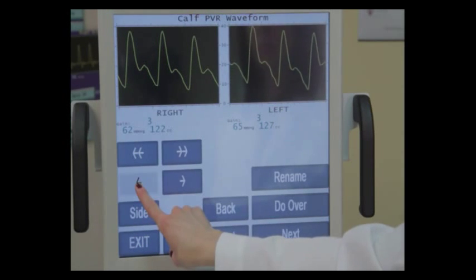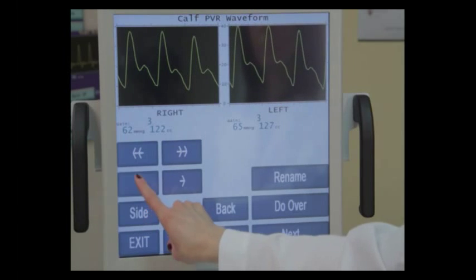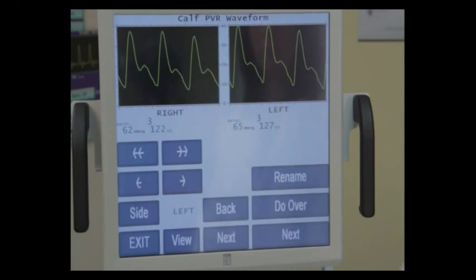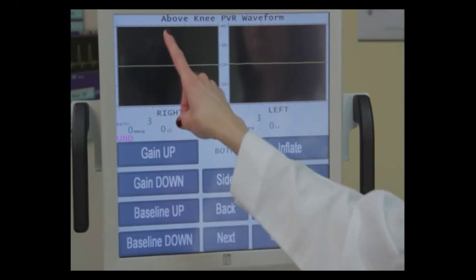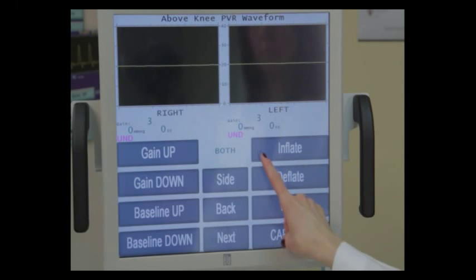Just one waveform over. Those look fine, so we're going to press next. And now we're going to be doing the above knee PVR waveform. You'll notice the gain stays at 3.